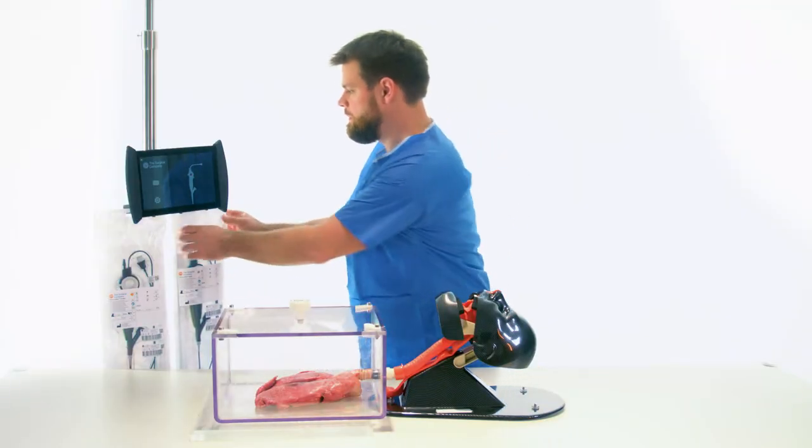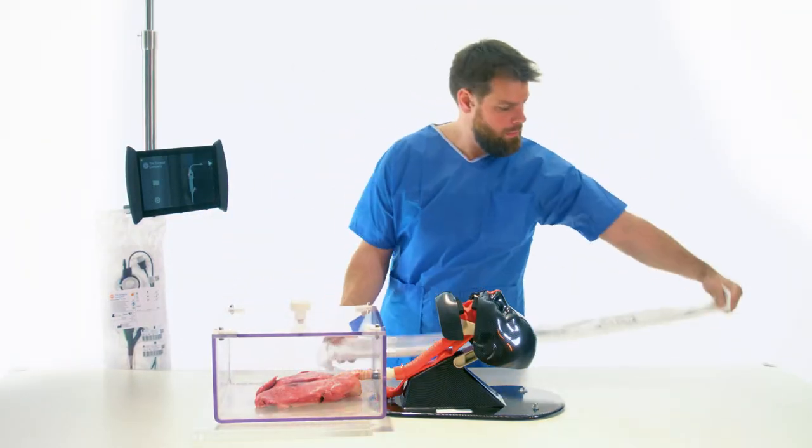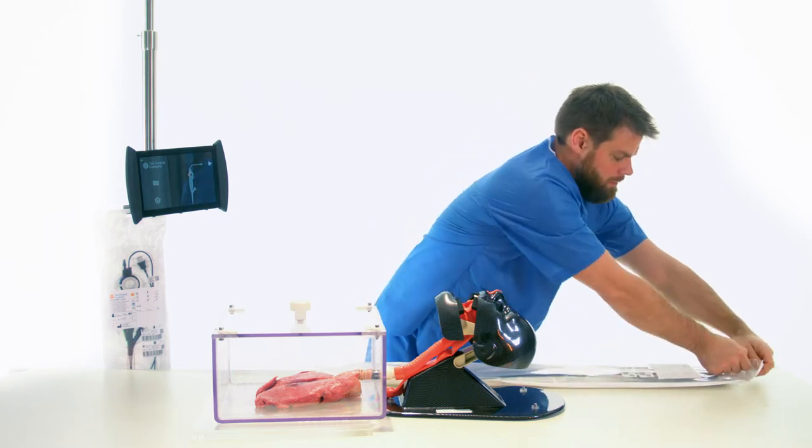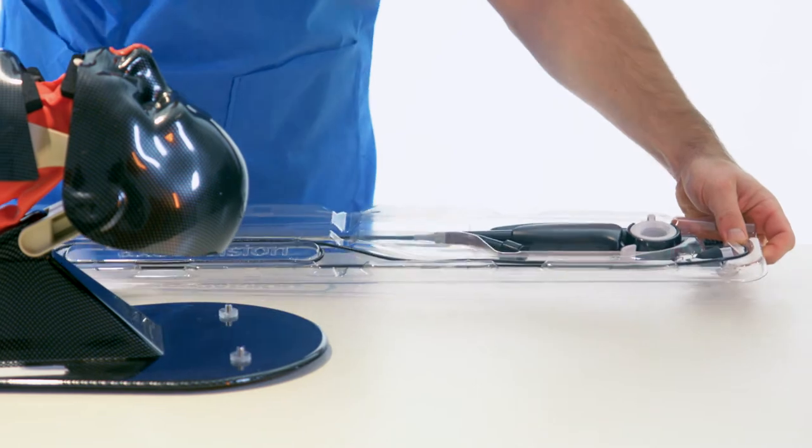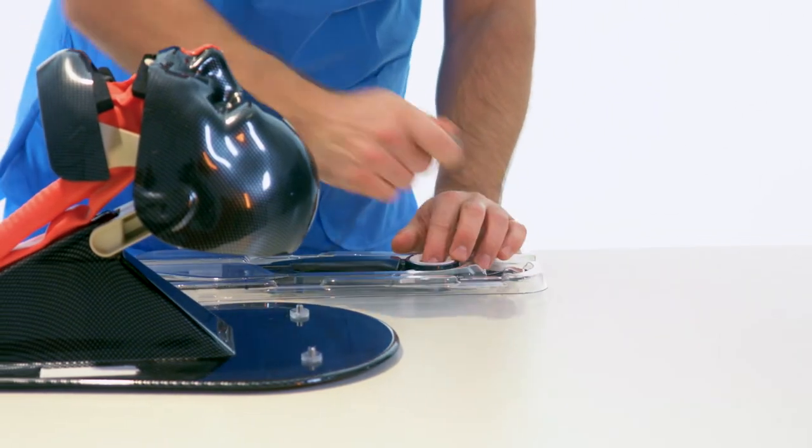For this procedure, a BroncoFlex Vortex with a 2.8 mm working channel is used for powerful suction. There are no protective covers or accessories that need to be removed.